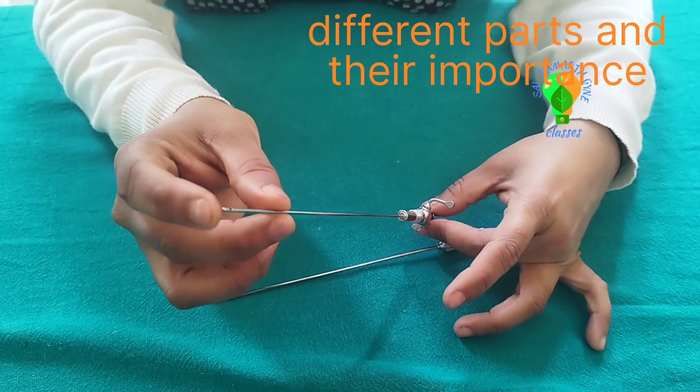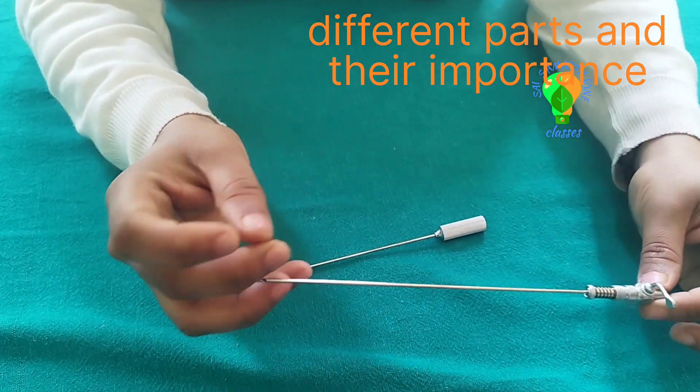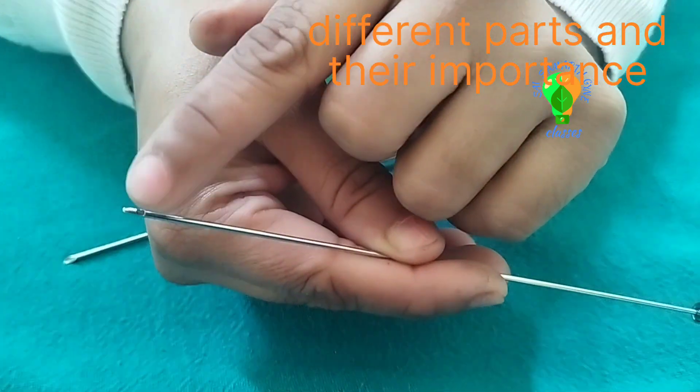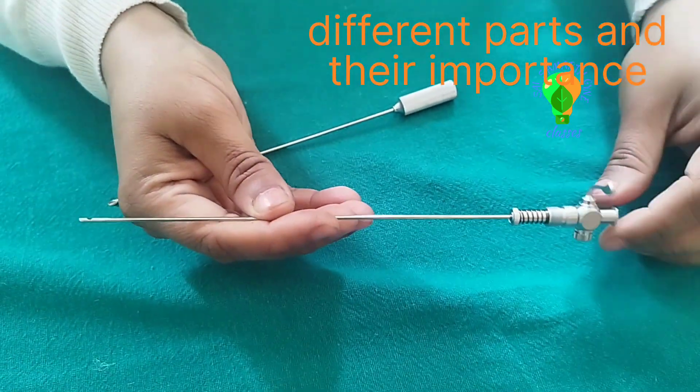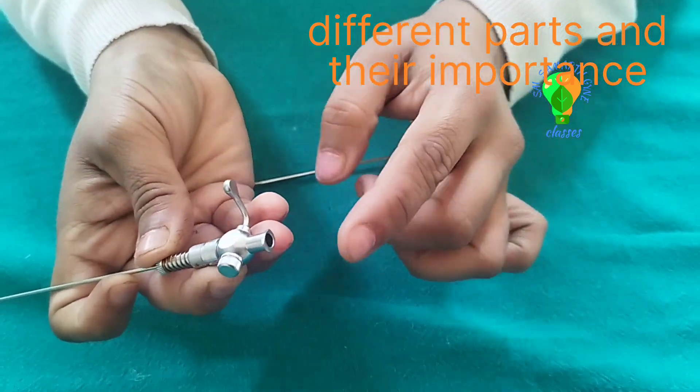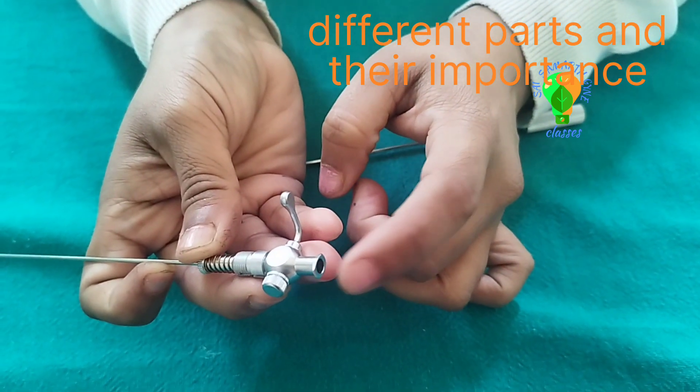This tip is blunt, and on the side there is an eye — there is an opening. Here is a valve. This valve is called the air entry. Here is the CO2 supply.